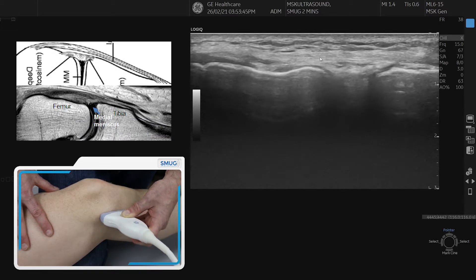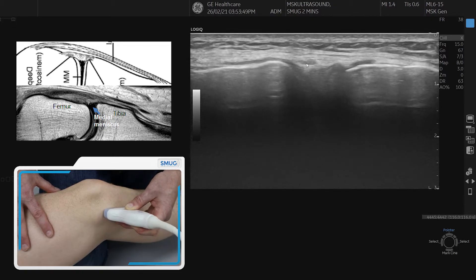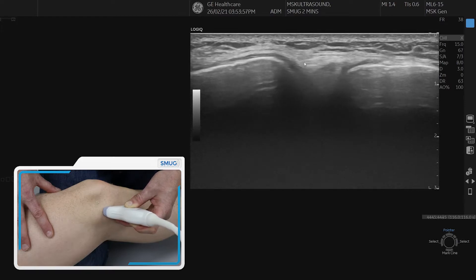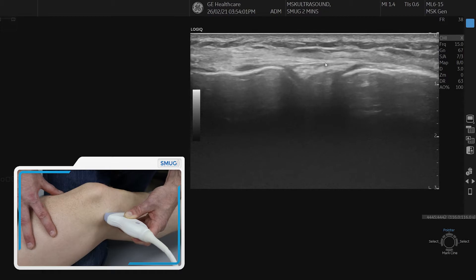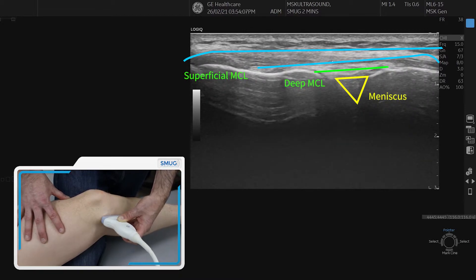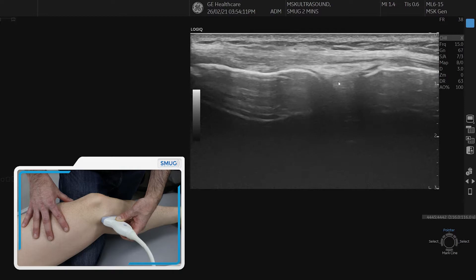The deep layer of the MCL sits on top of the meniscus. The peripheral margin of the meniscus is here at the anterior edge, and on top of that the bright, hyperechoic structure is the deep MCL layer. It anchors to the tibia and to the femur, and it's stuck to the meniscus. So you've got the superficial layer going over the top and the deep layer below, adhering to the meniscus.